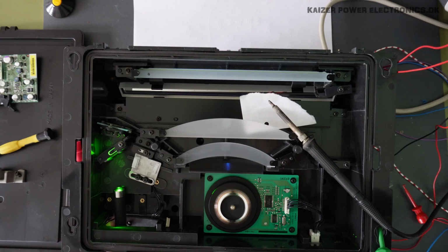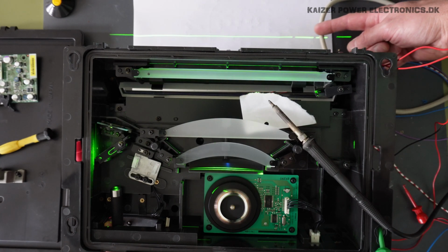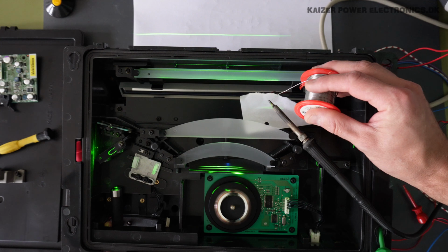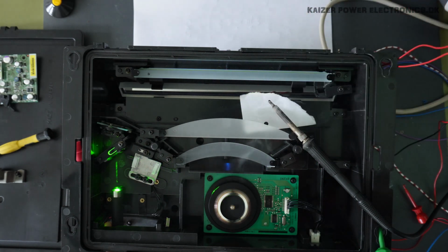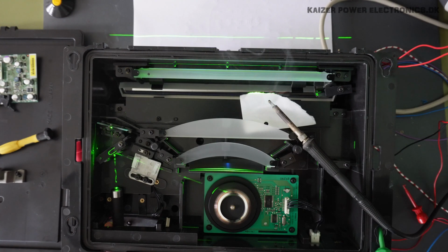Okay, so trying to hand align a laser into this is not that easy, but I got a feeling where it was mounted. Just have to watch that beam going somewhere. Okay, so here we have it. The line we see up here on the paper is the actual output to the image scanning plate. And if I can just get my very simple smoke machine to work here. Like that, we are able to see the beam.